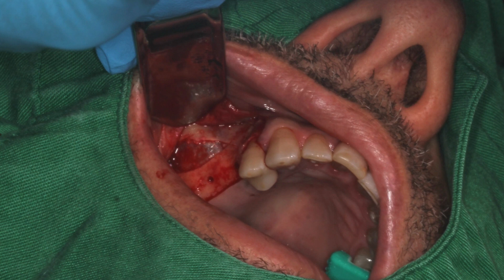I usually put a little bit of sharp creases on the tip of the Minnesota so that this ascending zygomatic buttress, which is very slippery and not that easy to handle, is easier to manage. So having some sharp edges at the tip of the Minnesota is not a bad tip. You see what I did there? Tip on the tip. Okay.